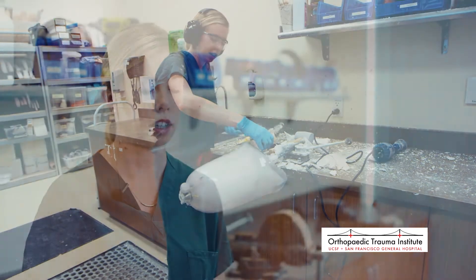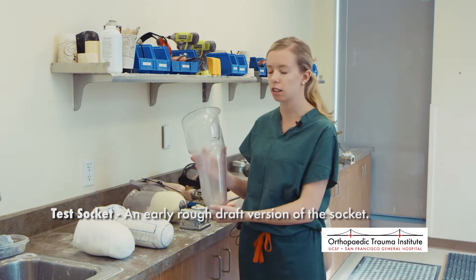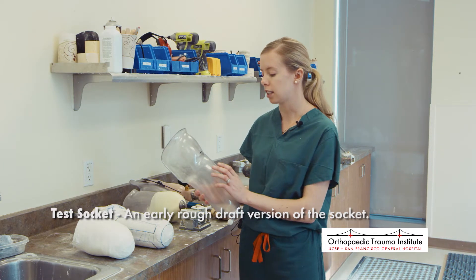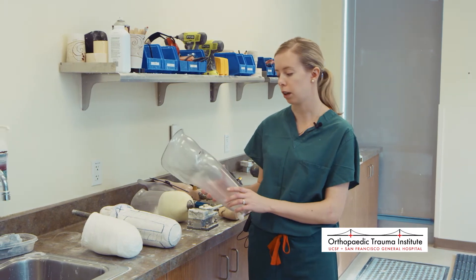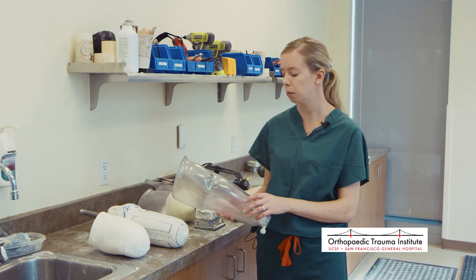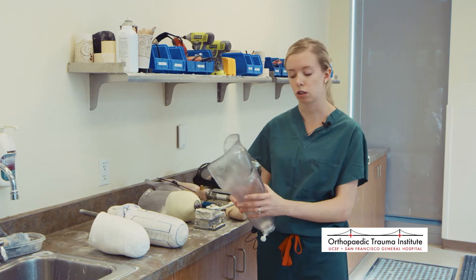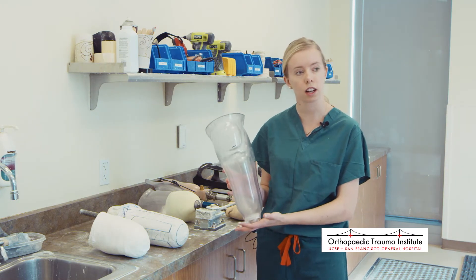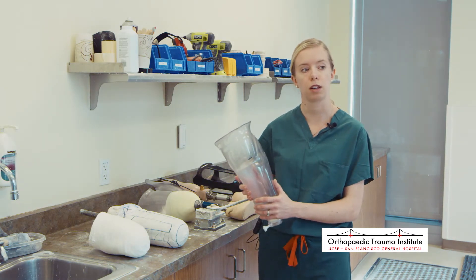Once we have it copied, we break out the plaster until we have a clean socket — that's what we bring to the initial test socket fitting. This is a plastic test socket, or rough draft version. The plastic is brittle, so it's not a long-term device, but it allows many changes in a short time. We can heat it and relieve painful areas or add pressure where we want it. This is the foundation of the whole prosthesis — if it isn't comfortable, the patient won't wear it, so this is where we spend the most time.